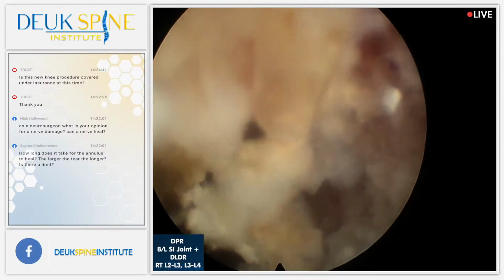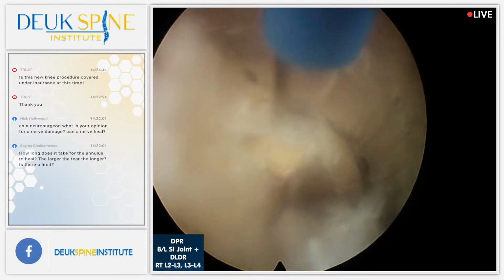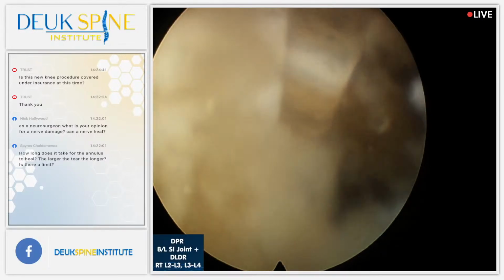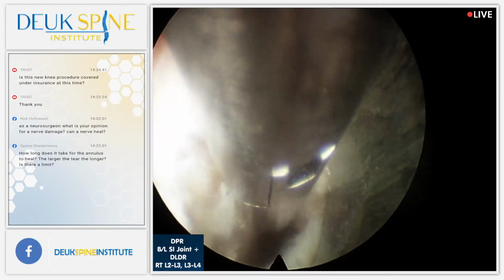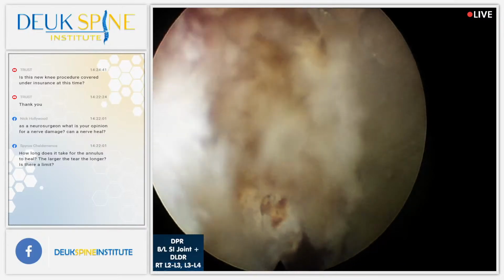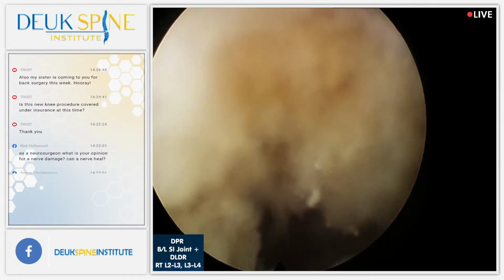All right, type your questions for me, and I'll be happy to answer them. The reason we don't see blue is because we didn't put any blue dye on this disc. We did on the other. Grabber. I think we're done here, doctor. Yeah, I don't see any more pieces. Looking good. She did great. There's the nerve root. Luis, let me just get this last little piece. Hold this right here.